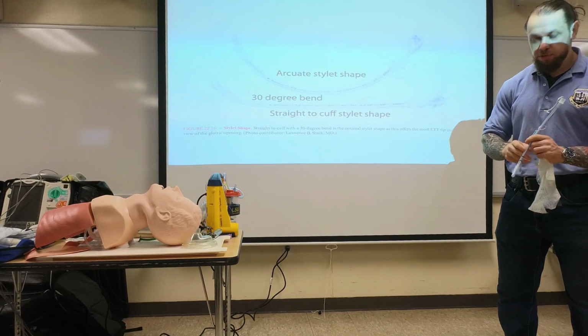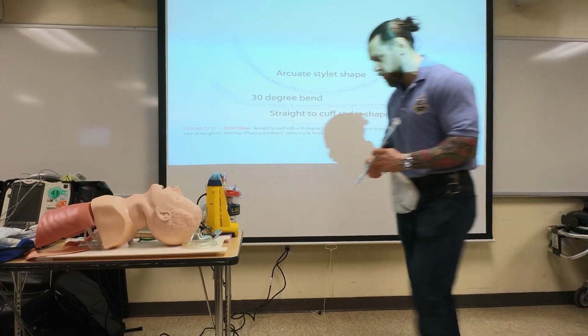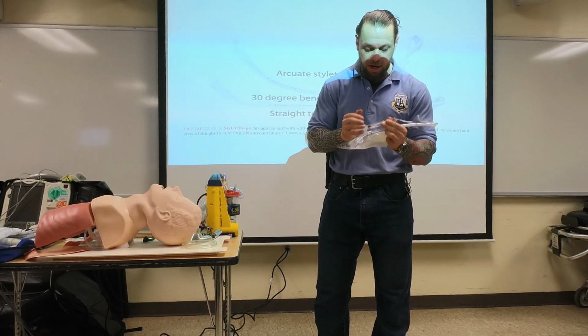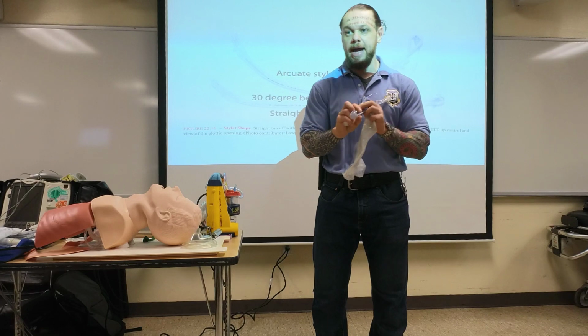Do I test the balloon? You can, in the package, to see the integrity. So what I mean by that, the balloon you're going to inflate. You're going to put air in here, and this cuff is going to inflate. You see that?